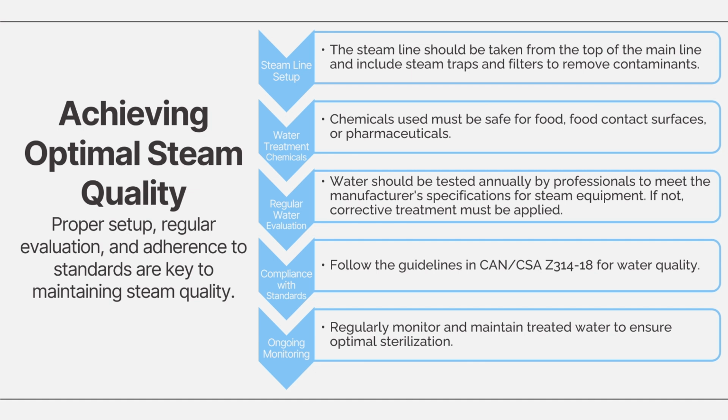So achieving optimal steam quality is essential for effective sterilization and protecting medical devices. This requires attention to system setup, water treatment, and ongoing monitoring.